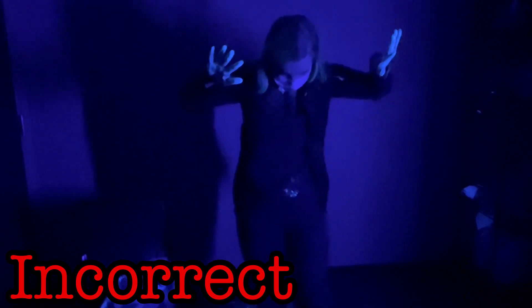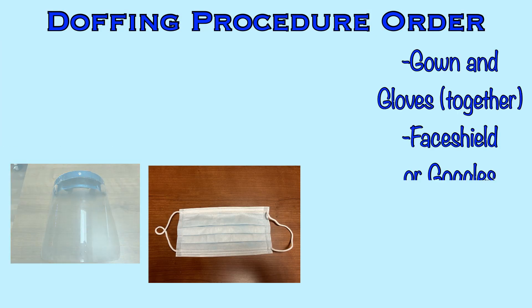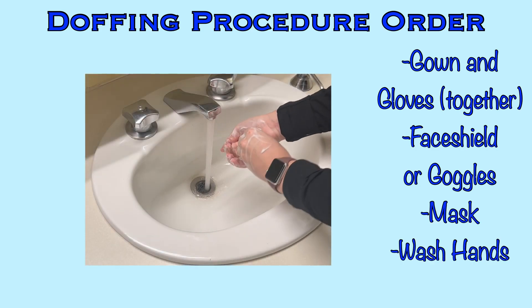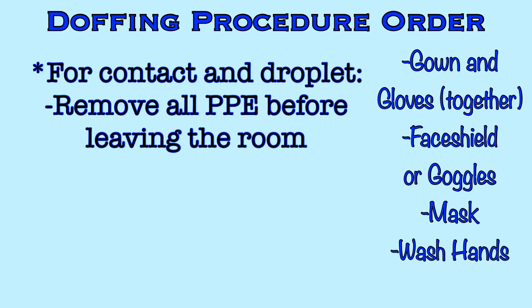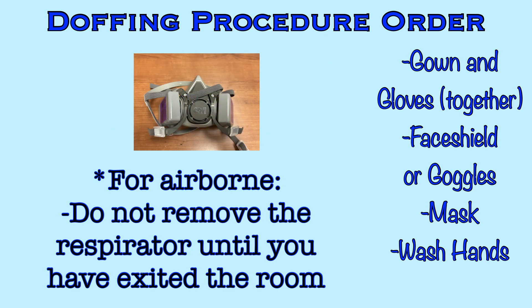The order is important. You begin with the gown and gloves, followed by the face shield or goggles. Then the mask, and then wash your hands. For contact or droplet precautions, all PPE should be removed before leaving the room. If the patient is on airborne precautions and you are wearing a respirator, the respirator should remain on until you have exited the room and closed the door. If you remove the respirator before exiting the room, you would put yourself at risk of breathing airborne contaminants.